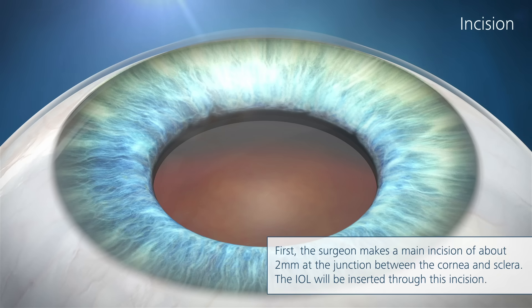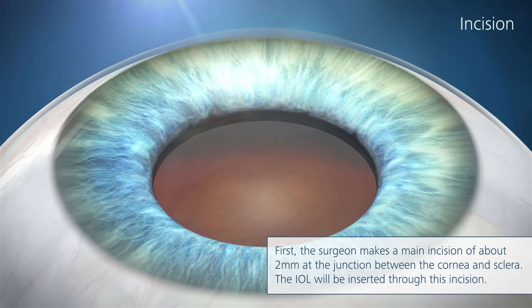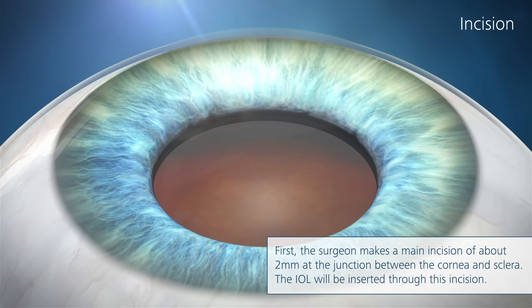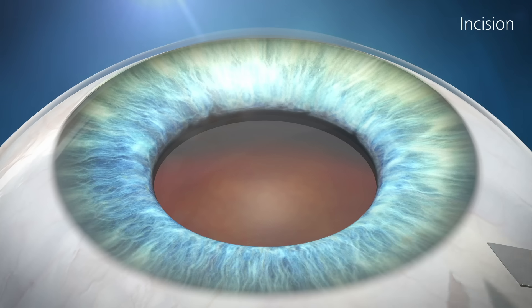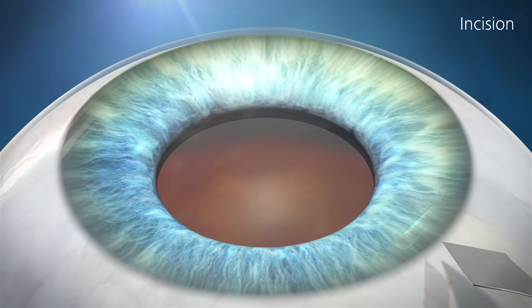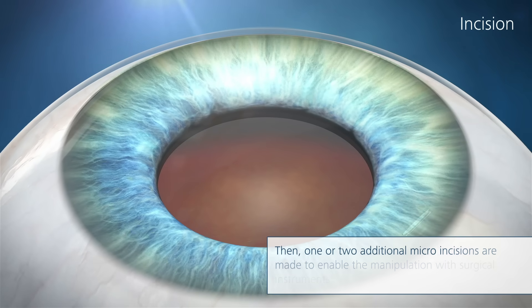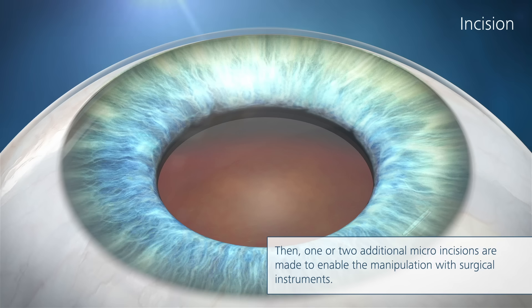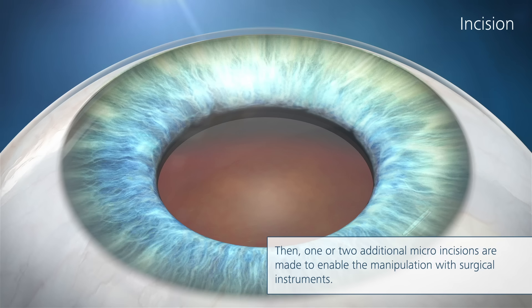First, the surgeon makes a main incision of about 2 millimeters at the junction between the cornea and sclera. The intraocular lens will be inserted through this incision. Then, one or two additional micro incisions are made to enable the manipulation with surgical instruments.